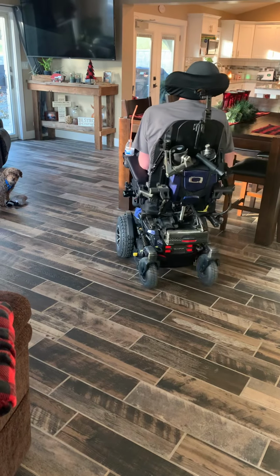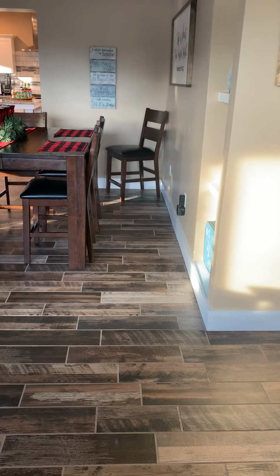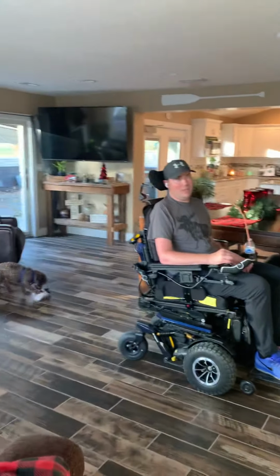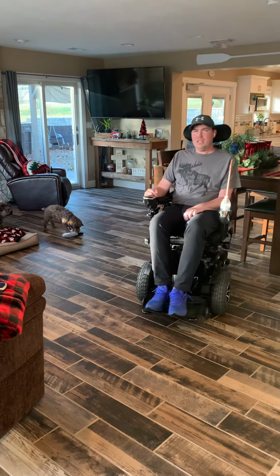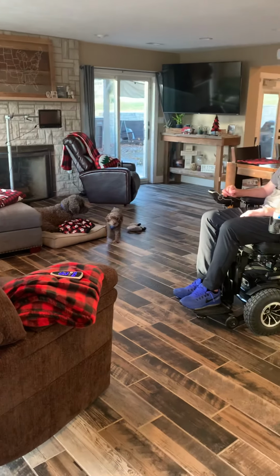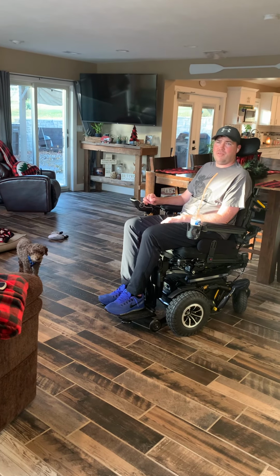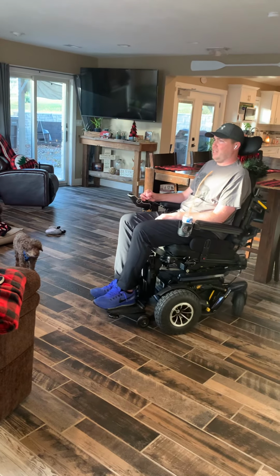And you can tell here on the wall we have the Alexa device, but we have them in every single room. So like here in the living room, I can say, hey Alexa, turn on living room lights, and she'll turn them on for us, which makes life so much easier. The cool thing is, as well, as you can tell by the fireplace, I have my Toby. As I'm starting to lose my voice, I can access the TV, all the lights, all the cameras around the property through Alexa and through my Toby. I can control it. So, very nice features.